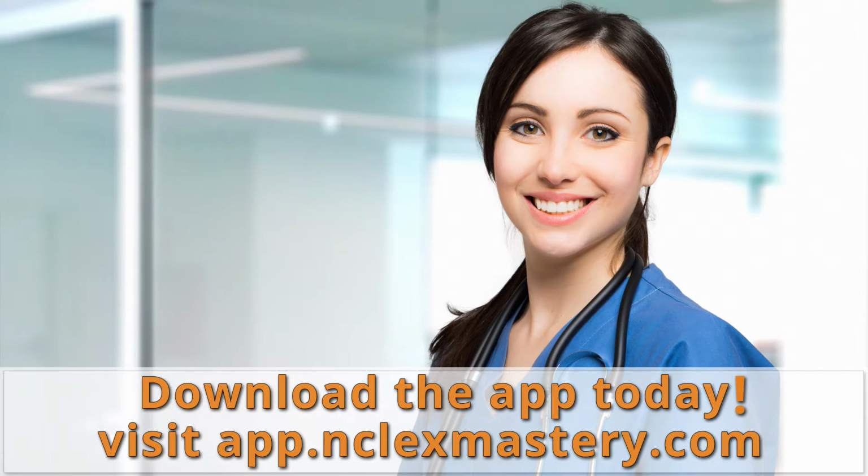Oxygen administration involves delivering oxygen to a patient at a higher concentration than is normally found in room air. This oxygen can be administered via various devices, each with its own considerations.